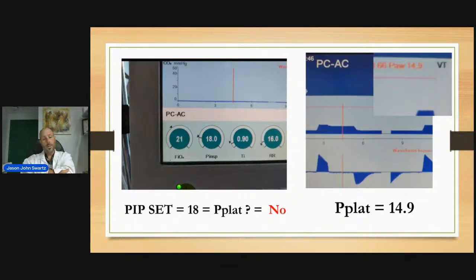So for the peak inspiratory pressure, there is an inspiratory time. There's gas flow occurring. So it's valid to do an inspiratory pause on pressure control. And also because you're on pressure control, you can then find the optimal peak, because your true drive pressure is that. So if it's 18, you just knocked off about 3 units of pressure.